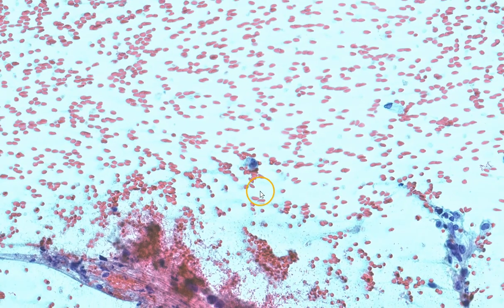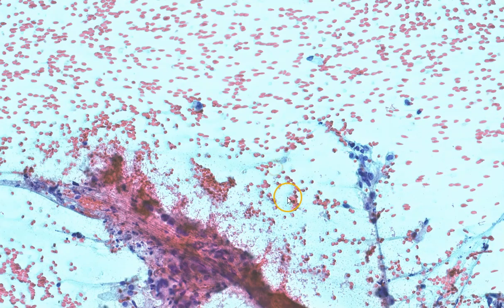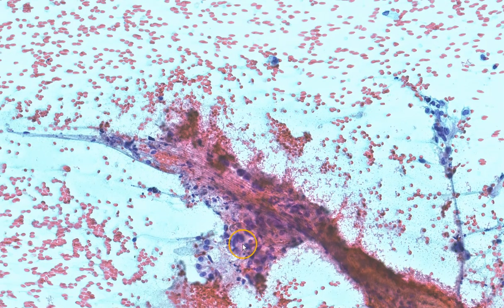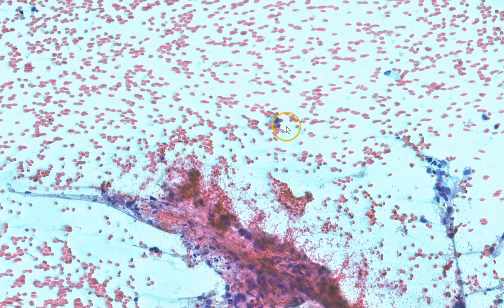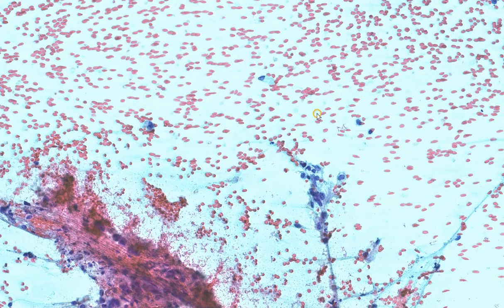Usually, we diagnose malignancy where there is sufficient architectural disruption, disorganization, and nuclear pleomorphism. This is also supported by the presence of these single, isolated, cytologically malignant cells in the background.